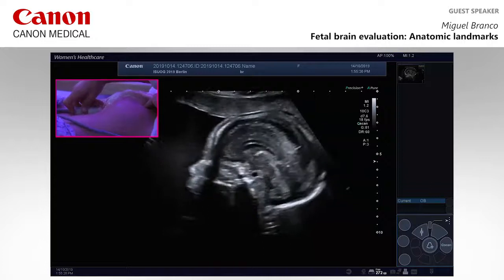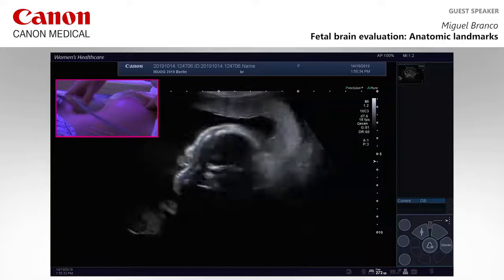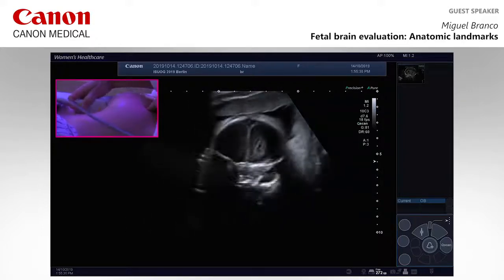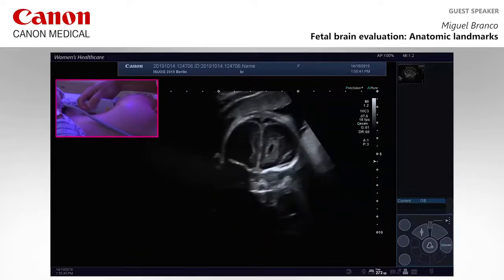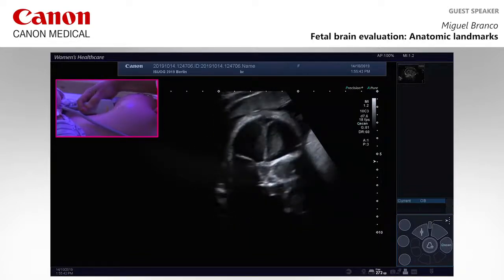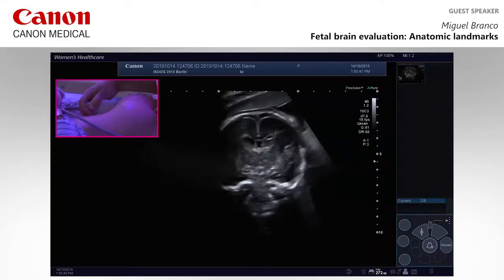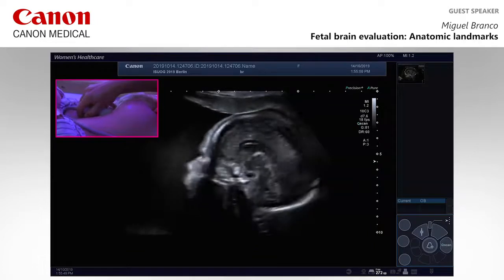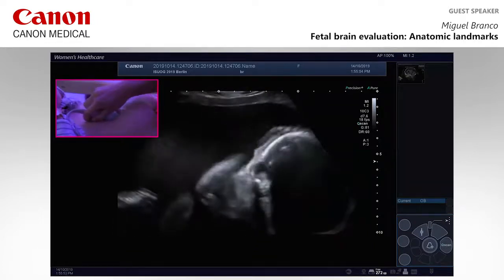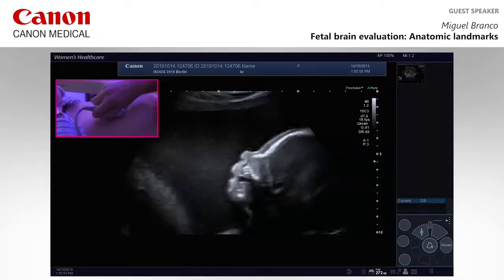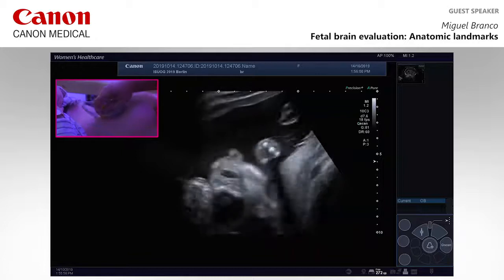From this point, if you turn 90 degrees, the probe will obtain the coronal evaluation, and we go up and down. We then return to sagittal evaluation, go to the profile, and turning 90 degrees we will obtain both eyes.